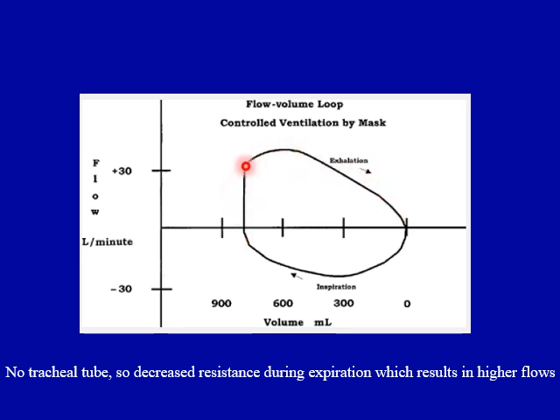So here, it is actually given as controlled ventilation. In controlled ventilation, the flow of gas usually will not be sinusoidal like this, but it will usually be either a decelerating flow or a constant flow.